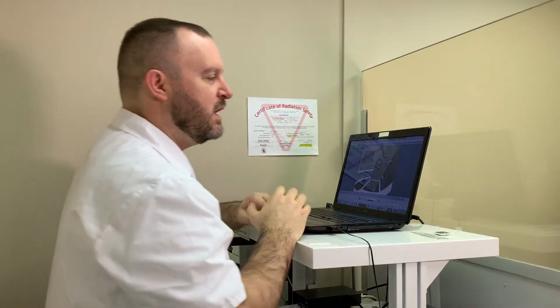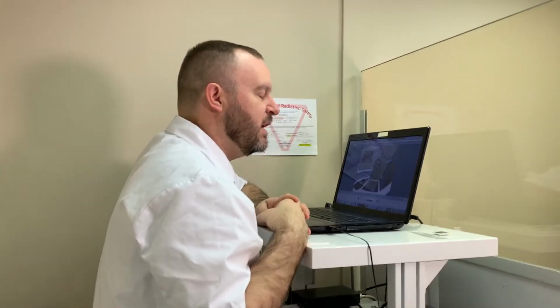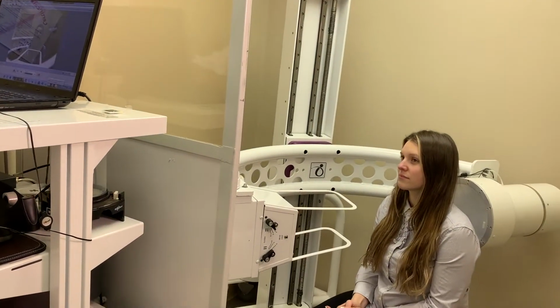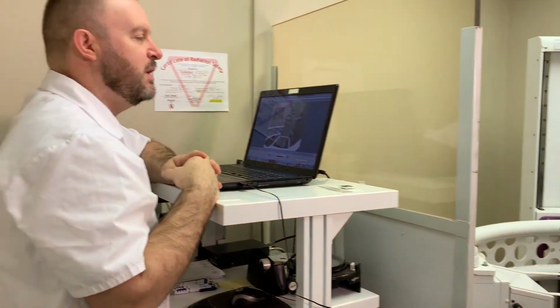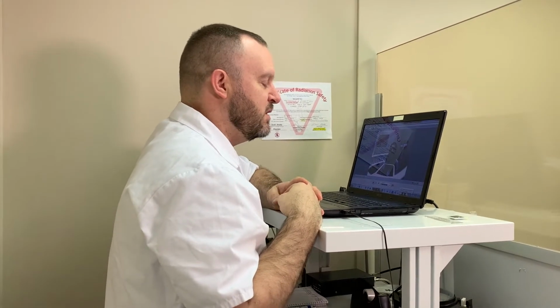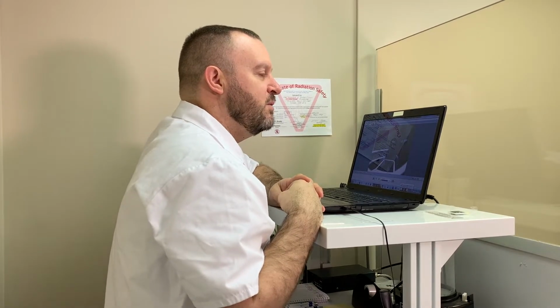I'm going to do 3 videos today to determine whether or not you have any instability in your neck. The first and the third video, I'll attach a ruler to your neck because they're uniplanar movements, so we can measure and quantify how much excess movement is happening. And the second of the 3 videos is 3-dimensional, so there's no criteria for measuring distances or anything on that one, so we just end up comparing the levels to each other to see if one is different than the others.